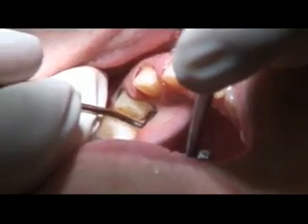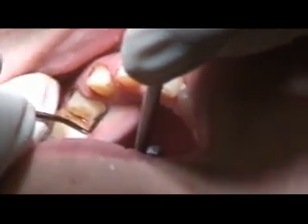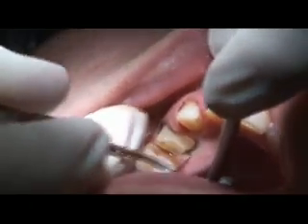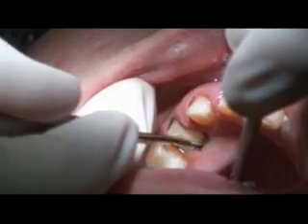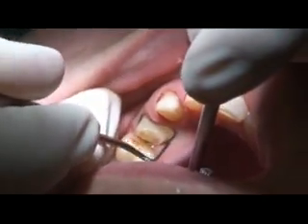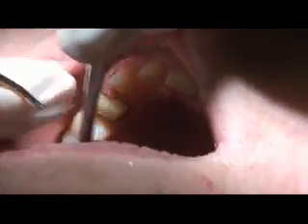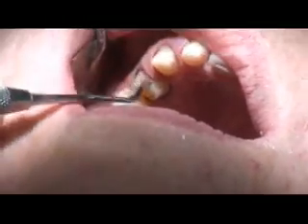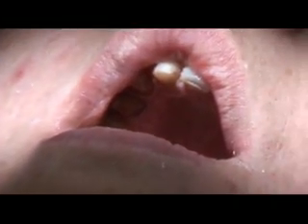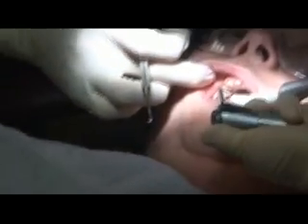Now, if there's a deep enough sulcus and you have a little overlap of cord, you can go ahead and put it overlapping, as long as you end up with everything in your first cord being below the margin. If it's not a very deep sulcus and you can't get both pieces of cord to go below the margin, then you're going to have to cut off your cord if it's too long. Next, we're going to rinse so we have a nice clean view. See if everything's below the margin.